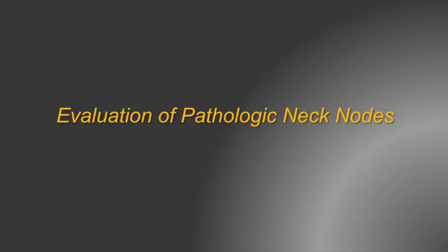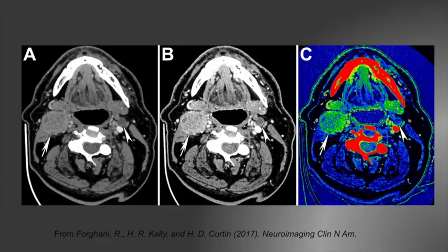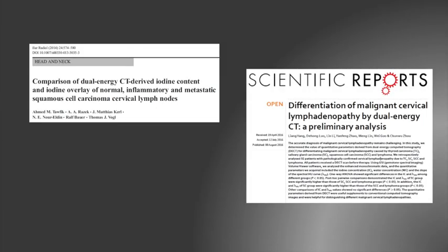There are some other applications of DECT. These include applications for evaluation of pathologic lymph nodes, as well as applications for evaluation of thyroid nodules. At this time, these have not demonstrated sufficient discriminative ability or practicality to be implemented clinically, but there are interesting areas for continued research.